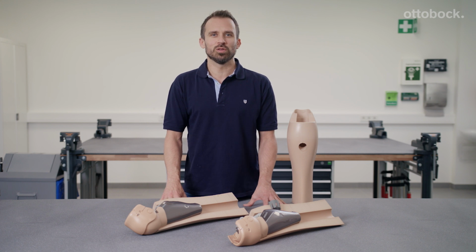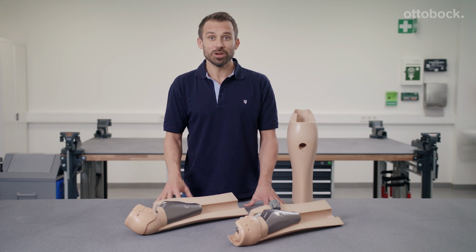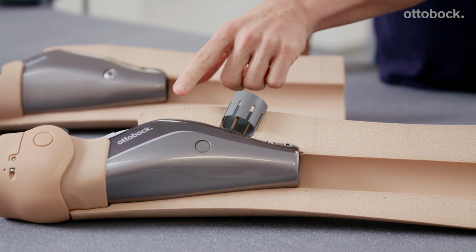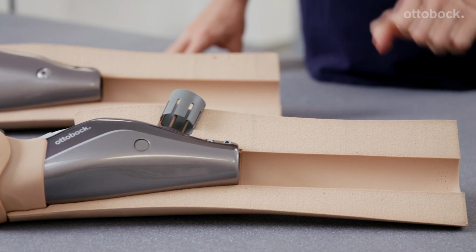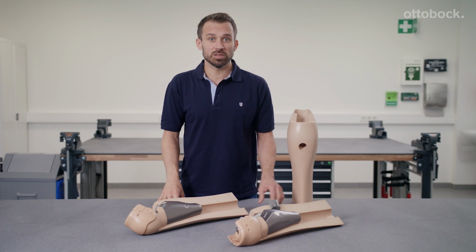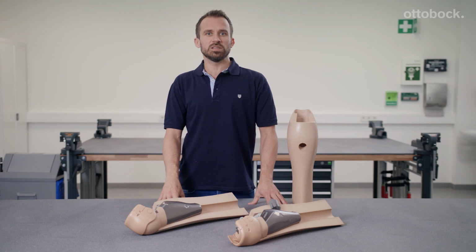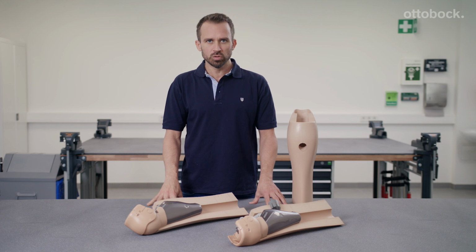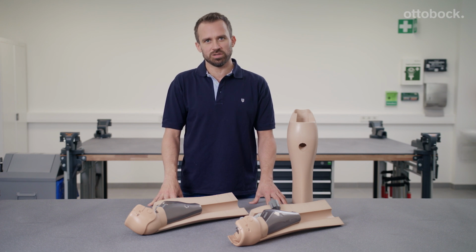Now let's move on to the functional shank. The shank offers a significant advantage. The contours of the knee joints are integrated precisely into the shanks. The shank part also has a large hole, as it makes it easier to pull it on and off if there are screws that protrude significantly due to the construction.